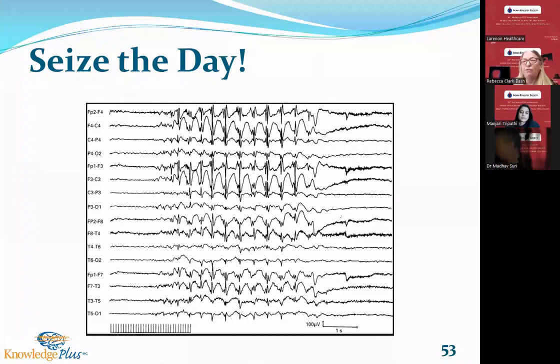And I think it's fair, given the history, it's easy to kind of ferret out that it might be hypoglycemia. But if it's not hypoglycemia, now we have a bigger challenge, right? Now we have to look to imaging as to why they would have less than optimal posterior dominant rhythm.